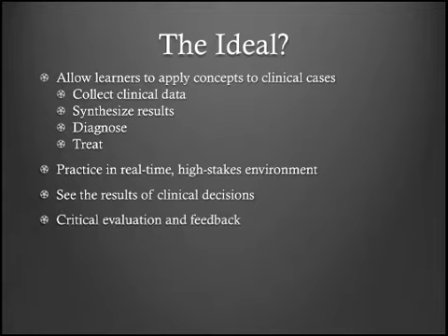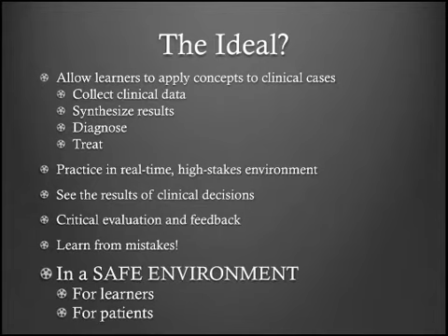they've made. At the conclusion of the scenario, they could get critical evaluation and feedback from an instructor, and ideally learn from the mistakes they make during the course of the scenario. And all of this would occur in a safe environment for learners and for patients.